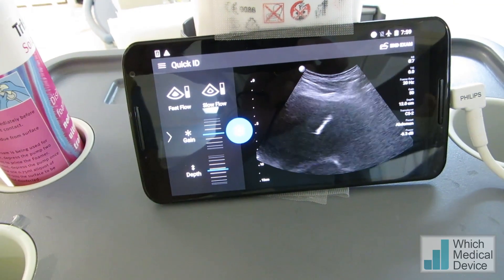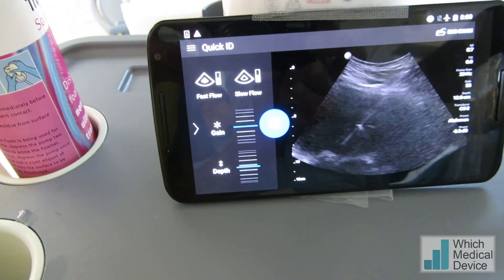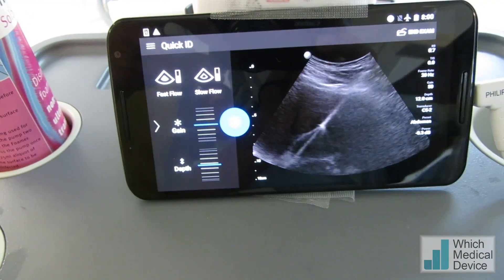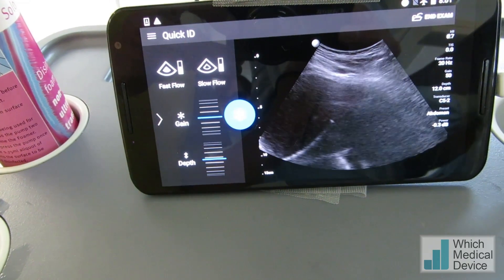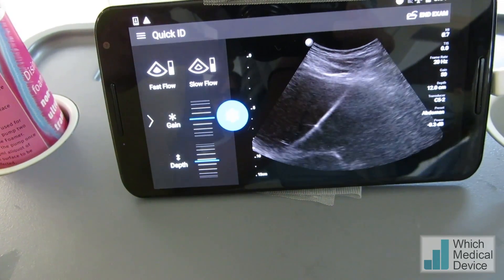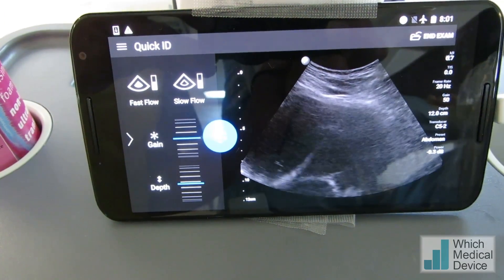We're now going to insert a guide wire, then insert a nephrostomy. I'm now introducing the guide wire into the dilated system — you can see that very nicely. And we're not even going to screen for this nephrostomy; we're just treating this as an abscess drainage. Now I'm going to remove the needle over the wire and insert the nephrostomy.